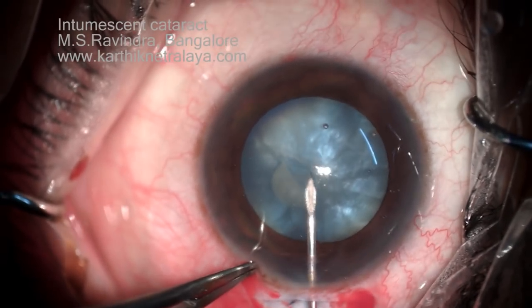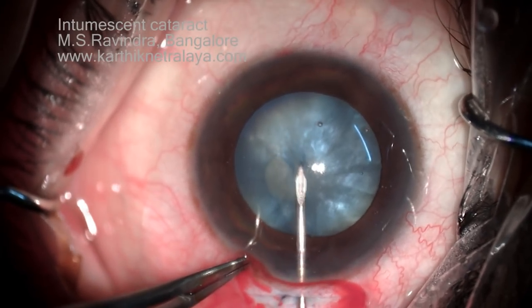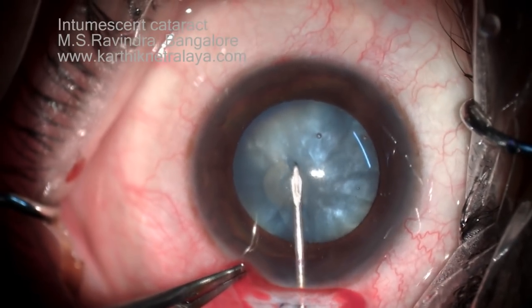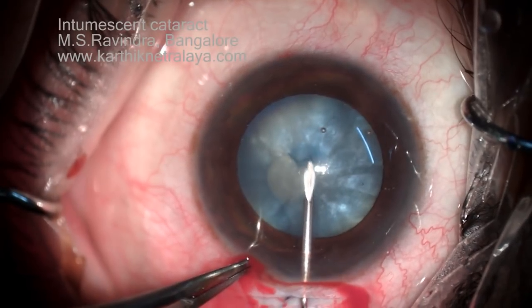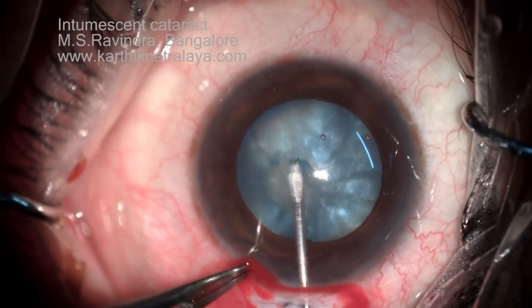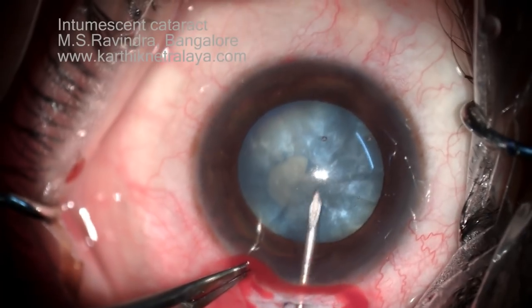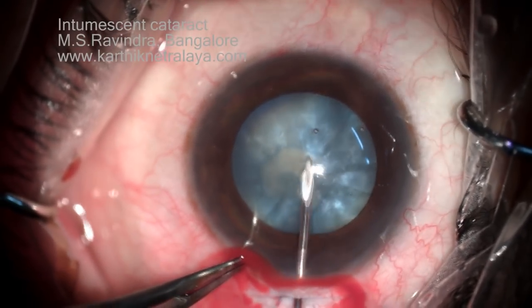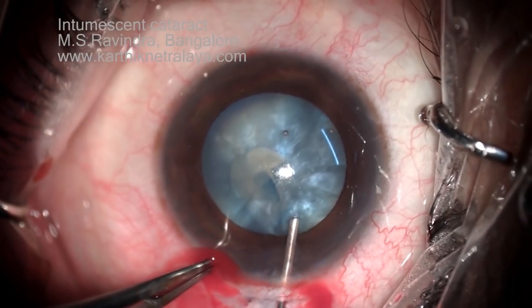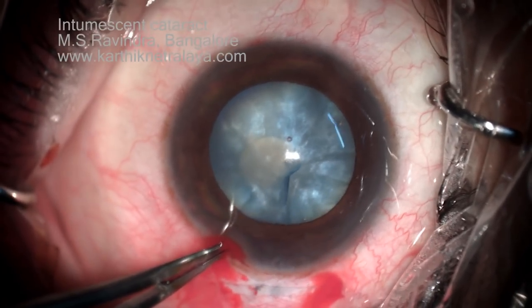It's quite a slippery situation. The base is very soft so I can't support the capsule to tear it. I am trying to extend on both sides of the axis so that the rhexis gets completed. It's not yet completed — you cannot stop at this situation otherwise it will run off to the periphery. Now I stop it in the center of the pupillary zone to reform the chamber.